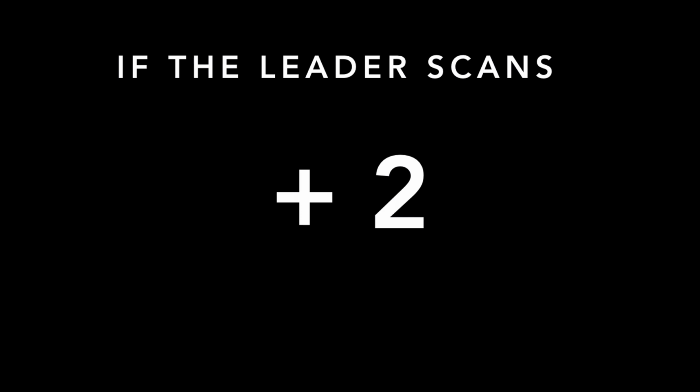Another important thing that came out is that if the leader of the resuscitation is the one doing the scanning, it adds time. So you should have division of labor. The person who is running resuscitation should not also be doing the ultrasound unless there is no one else. So one way to reduce by the whole 8 seconds would be to get transesophageal echo. Now there are barriers here. You have to be trained, you have to get the equipment, but there's a lot of advantages as well. That's for another lecture.